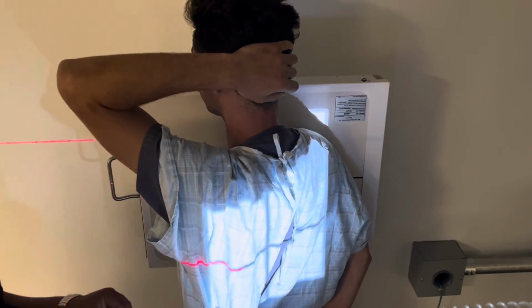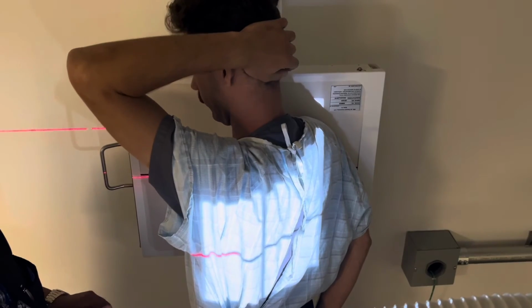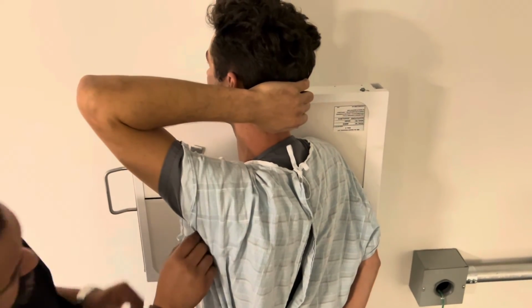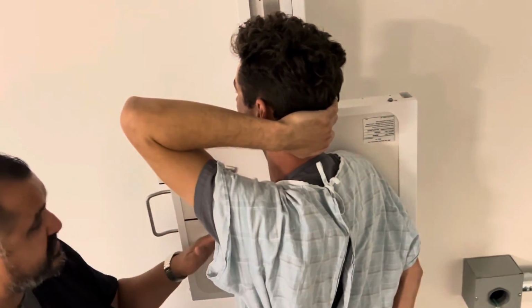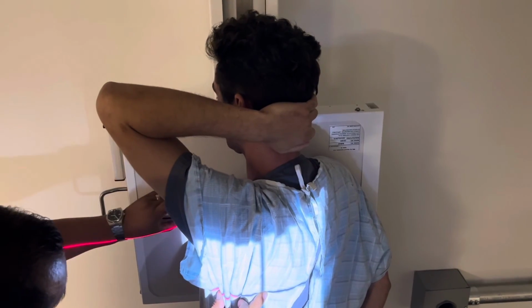So now, right there. Let's see where I'm at. I place it right over here. All right, so I place my left marker up here towards the top portion. I might get it in the humerus a little bit, but at least I'm not going to get it in the ribs because I don't see any light on this side. There we go. You know what, let's keep it right there. So I think I'm good right here.